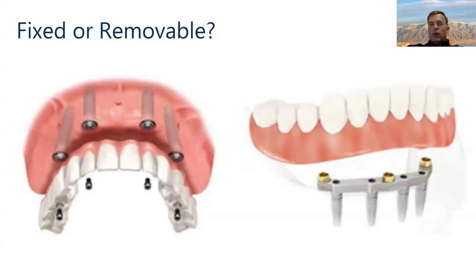If you have a patient who lost all their teeth due to perio and doesn't seem to be very interested in home care, removable may be really important. One other thing that a lot of times people don't think about is that some implant systems have more prosthetic options than others. Especially with removables, sometimes you can be limited by the options available for the platform that you have. So as you're selecting your implant system, you want to think about, does this give me all the options that I want, or am I going to be kind of forced into a narrow lane?